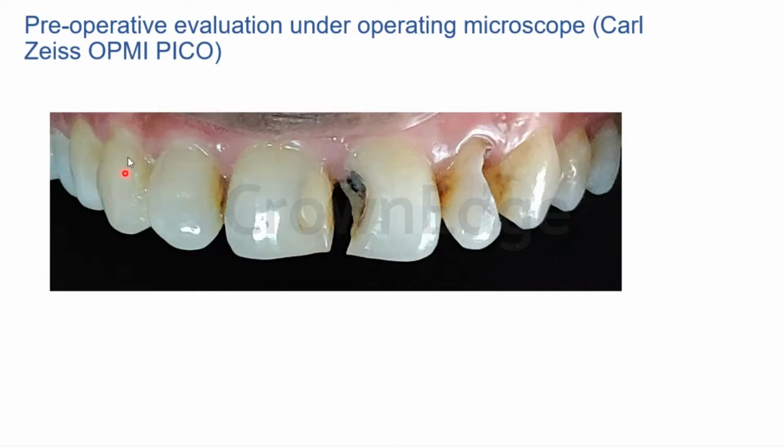So you can place small globules of composite. You can just take a little bit of composite, do a little bit of spot etching, or you can just place it over the teeth with a little bit of bonding agent and cure it for about 5 to 10 seconds, and you'll get the exact shade. So you can use probably A3 over here, A2 over here in the middle third, and A1 or different kinds of B2, and all those shades placed over here. And then you can select which shade is corresponding to the tooth the most, right?